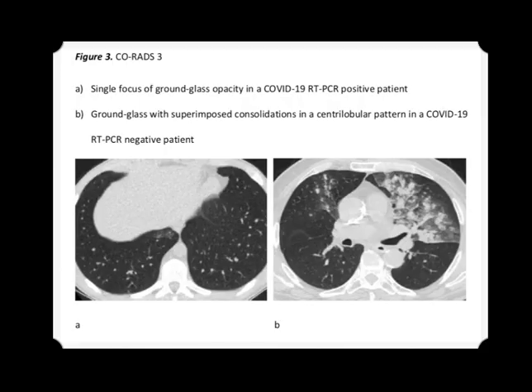An example of CORADS 3: a single focus — an RT-PCR positive patient showing a single focal ground glass opacity — and ground glass opacities with superimposed consolidations in a centrilobular pattern in an RT-PCR negative patient.